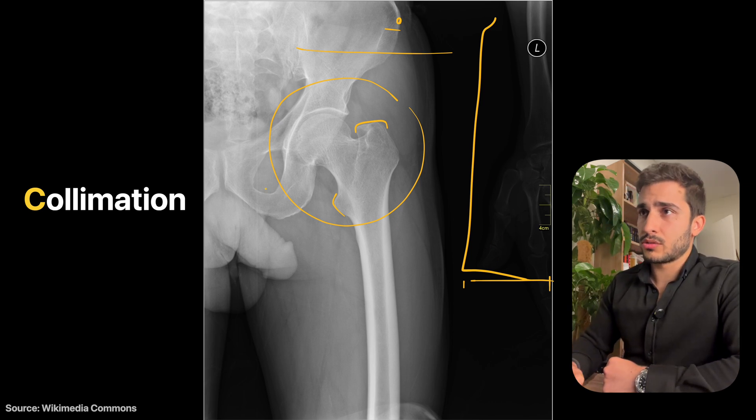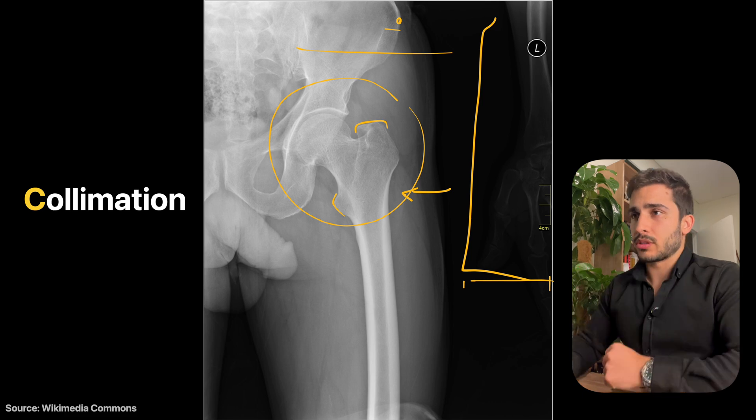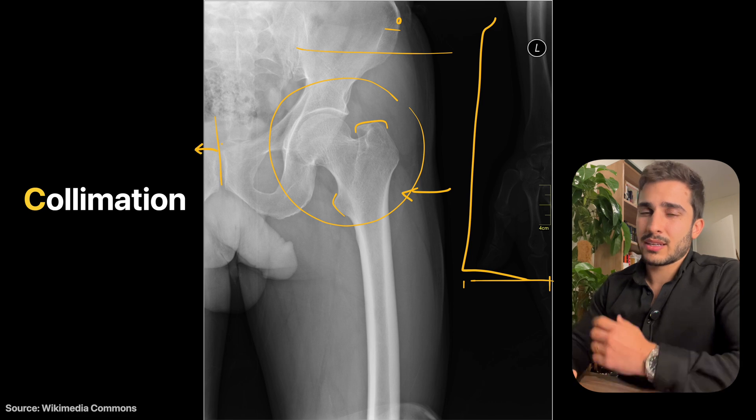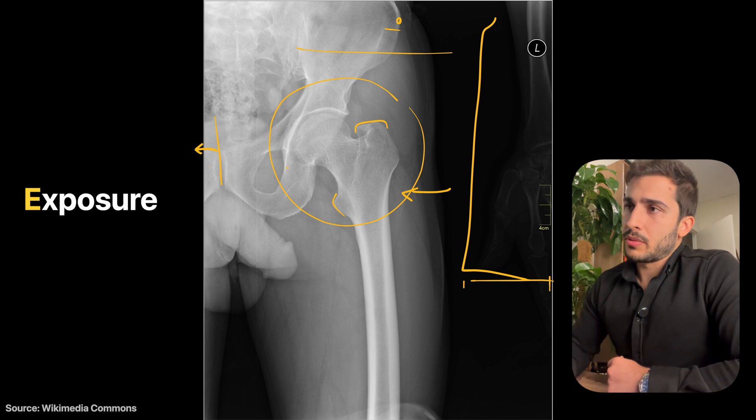Top-to-bottom is good. Side-to-side, mostly on the outer side is not ideal — the centering should have been shifted slightly and then collimation brought in side-to-side. Generally, anything beyond the pubic symphysis area isn't needed. So that covers centering and collimation.